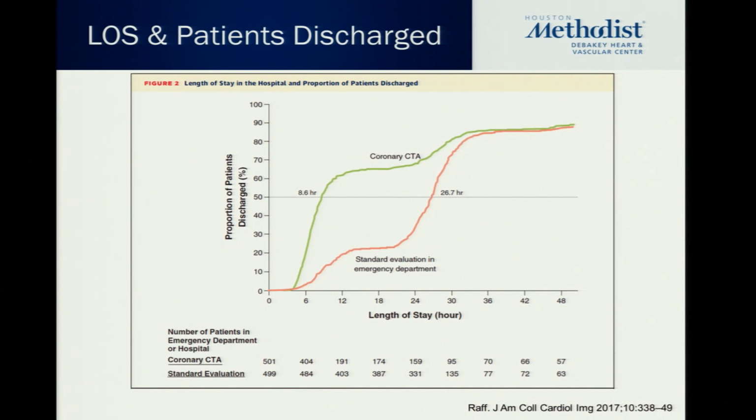Now, one caveat to all of this is obviously, how are you doing your stress studies? Are we using stress-only protocols? There's so many things. But these were 4 trials. They all were consistent. The protocol they were using was rest stress imaging, and this is what they were demonstrating.